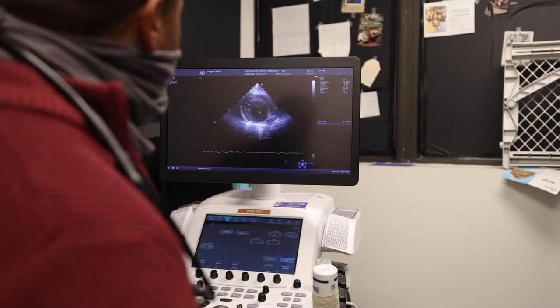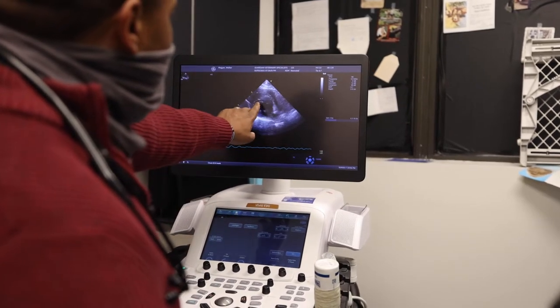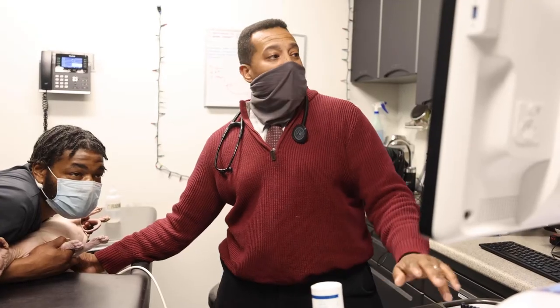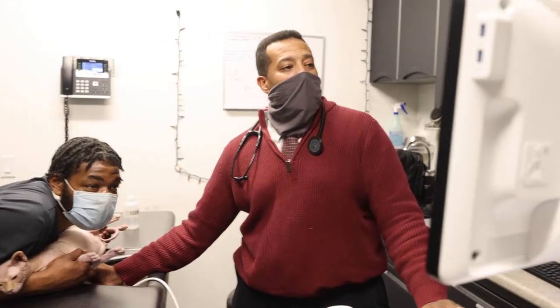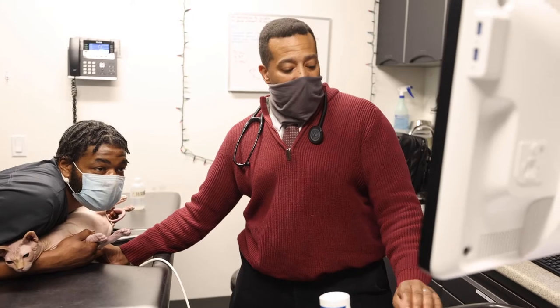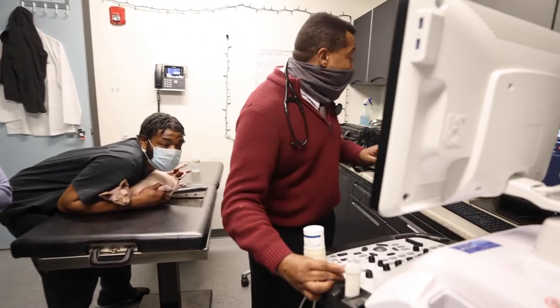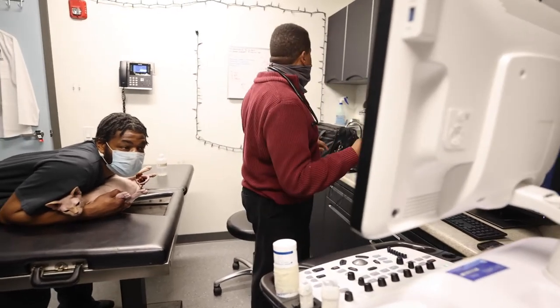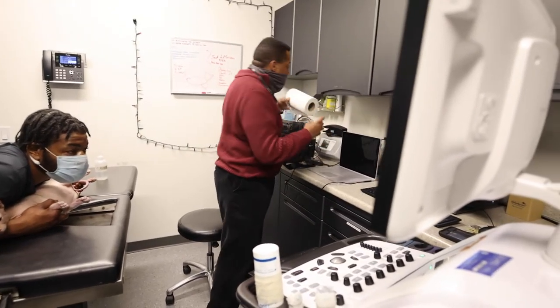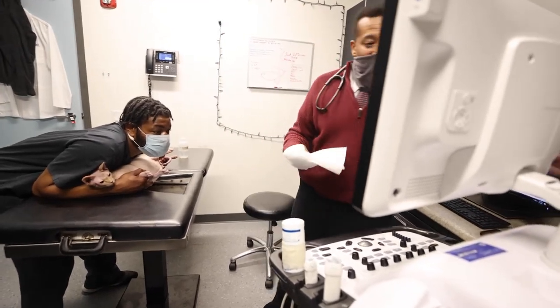Of course, our biggest concern is the size of this left atrium versus the aorta. They're almost the same size, those two circles. That's gorgeous. This breeder does a very good job with her line, testing good and echoes good. You just have to remember that their prime time for developing HCM is between the ages of 3 and 8. So he's still a little young for the real disease.